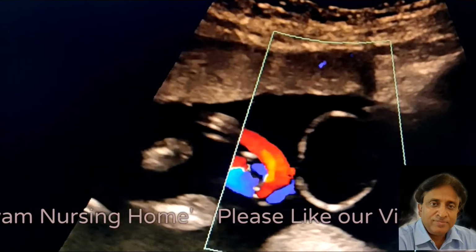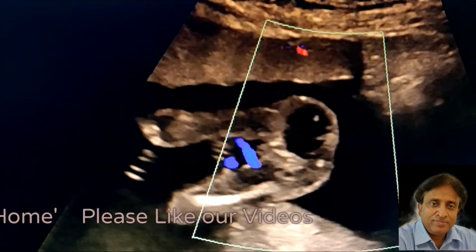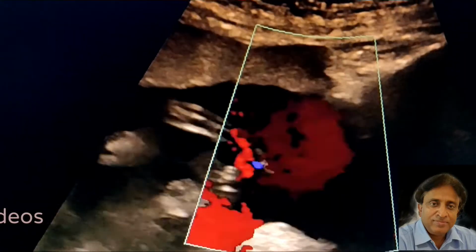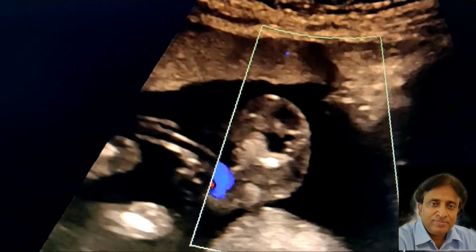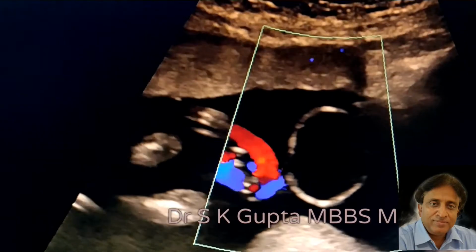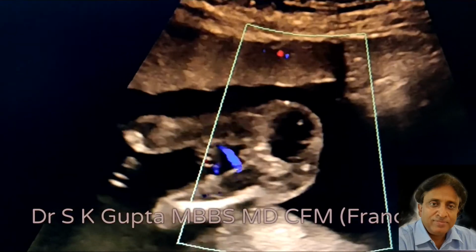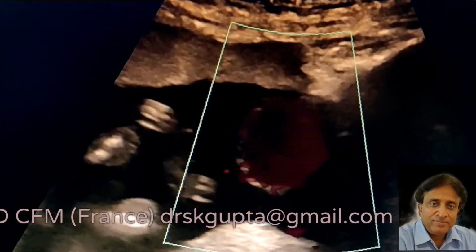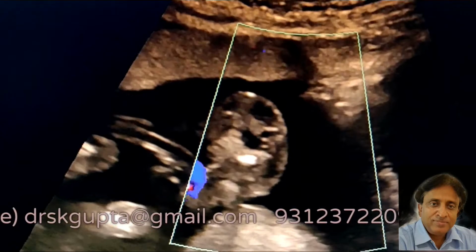It has to be differentiated from the pseudomeningocele, which might appear as a cystic collection, but it does not have any meninges, and there is no spina bifida defect in these patients. But the patients with a meningomyelocele or a meningocoel will have an associated spina bifida defect. So this is a case of isolated meningocoel of the sacrococcygeal region.